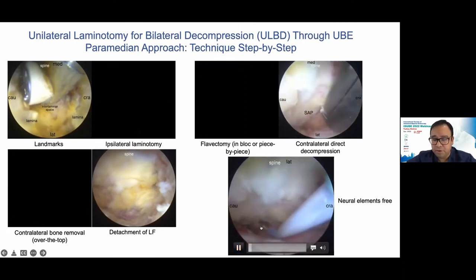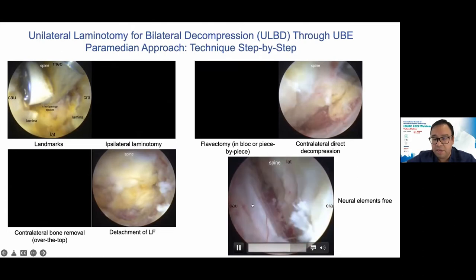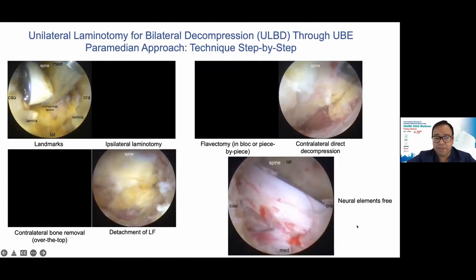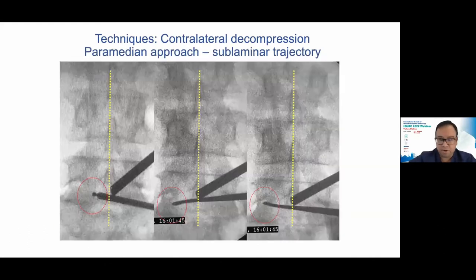As in this last video, you can see in this view how we decompress the proximal trajectory of the traversing neural element and the thecal sac. So the most important thing, I believe, in spinal endoscopy is that you can confirm your landmarks and your anatomy with the great visibility that UBE can give us. Also, you can complete your contralateral decompression through a paramedian approach, removing your medial facet, or through a sublaminar route. You can cross the midline with your instruments and reach the contralateral side. It's very easy, but the first cases are the base where you can get more experience and perform these approaches.